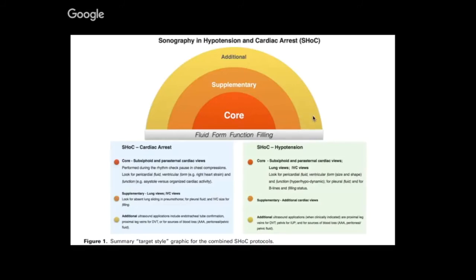And so this is a Delphi model that begins to make more of an expert opinion based approach to a shock exam. That next stage would be to test this versus, say, the rush exam for which one helps you perform better, faster.